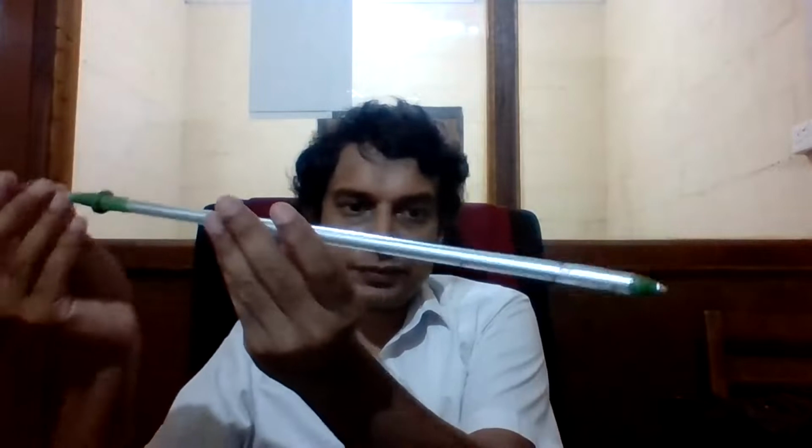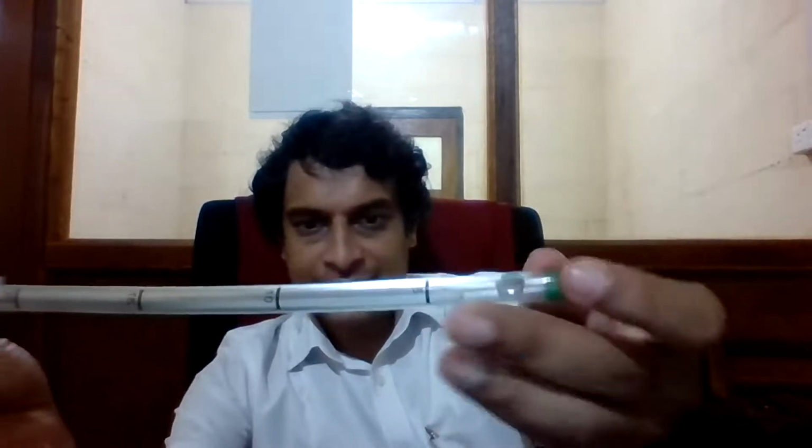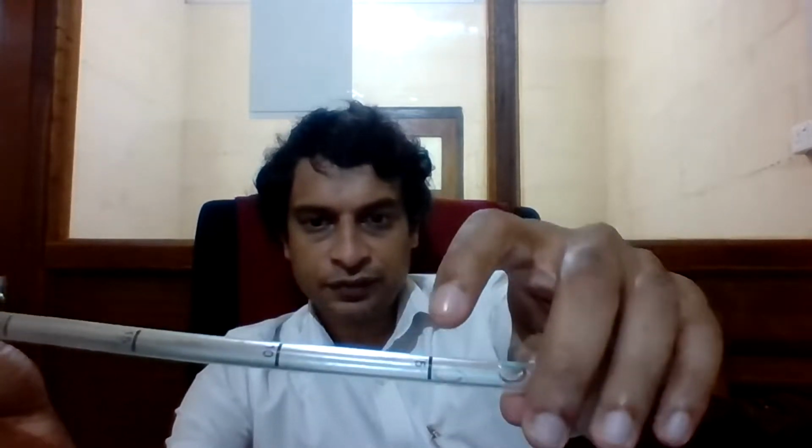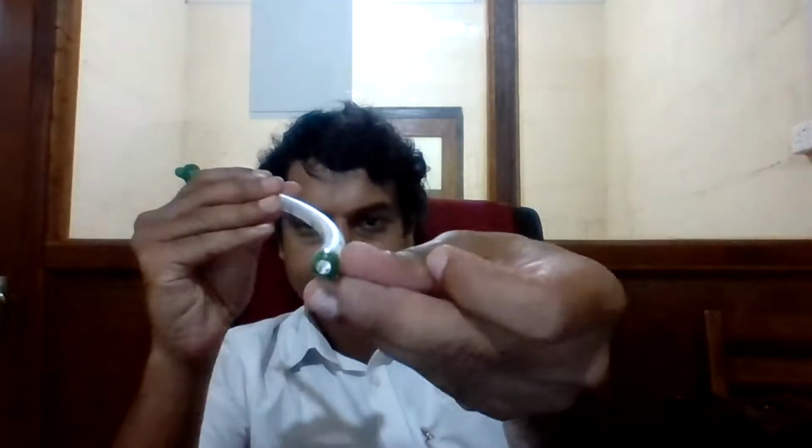So this is an intercostal drain tube. Some of these have a metal stylet that goes through them. This one, a sharp stylet, right? We commonly don't use these when we insert tubes. We take the stylet out and throw it away. Someone takes it to clean their sink with usually, right? We don't use it. So this is the tube. It's a flexible tube, right? And you will see that it is numbered with centimeters here, 5 centimeters, 10 centimeters, and it's got a hole at the tip and it's got a few side holes as well.